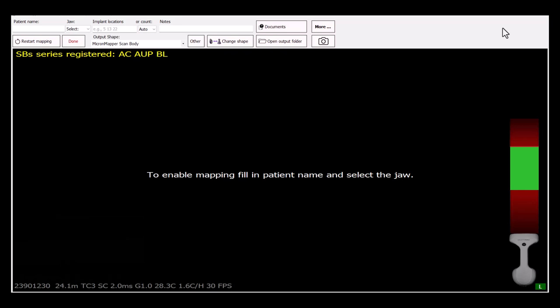Essentially, it allows you to do a try-in without having a patient present in a chair. It will require a special set of scan bodies to be used with your fabricated restoration.